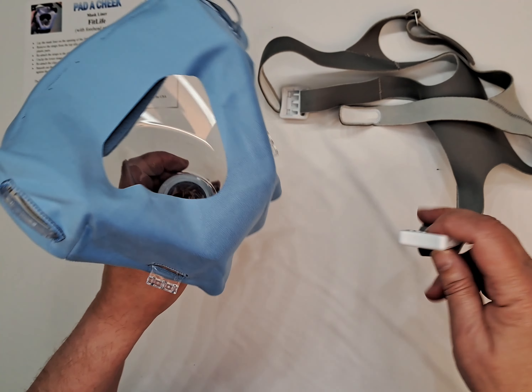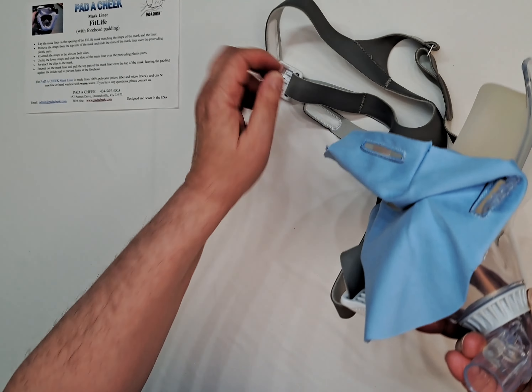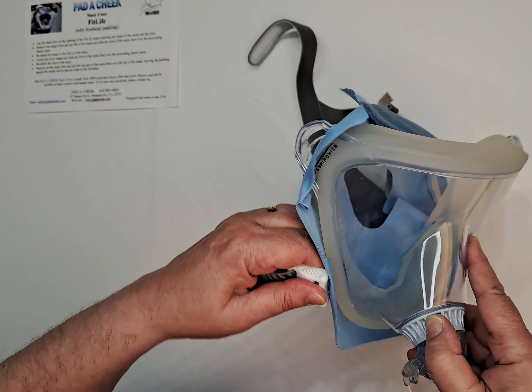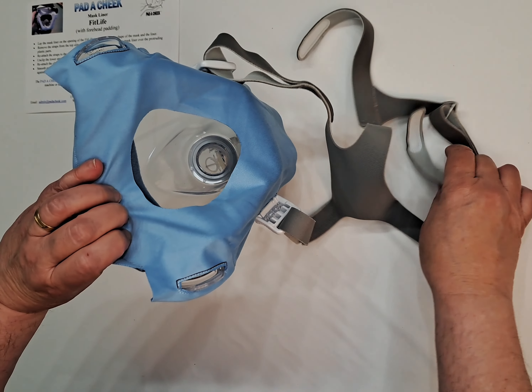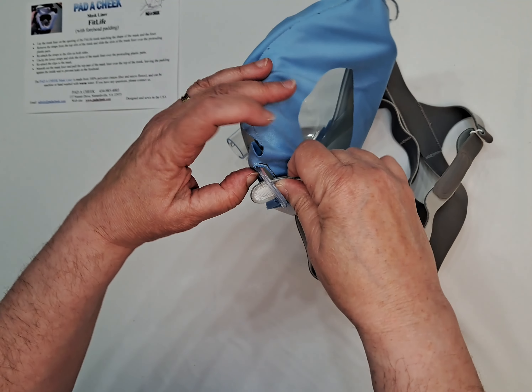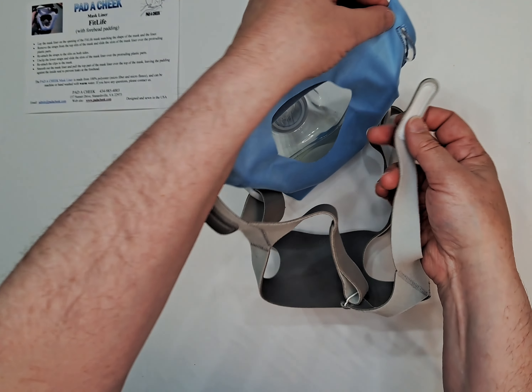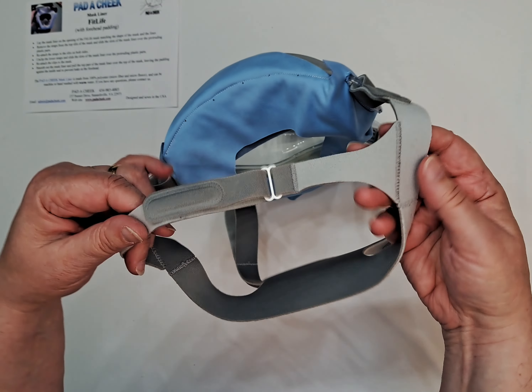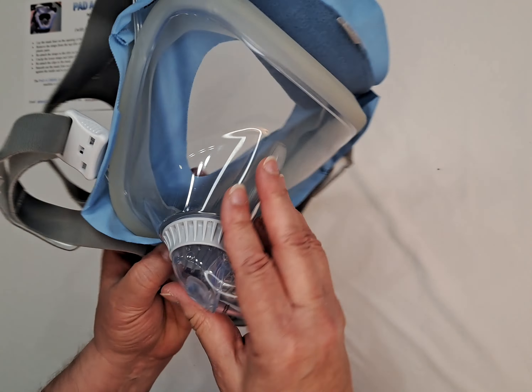The second part is to reattach the headgear straps. Just click on like this for the bottom straps, and the top straps go through the slit on both sides like this. Reattach it, and that is how you install the FitLife Mask Liner on the FitLife Mask.